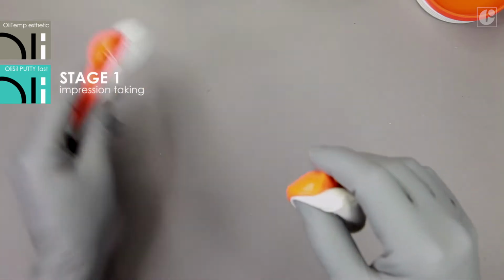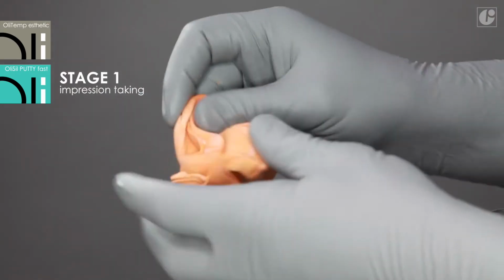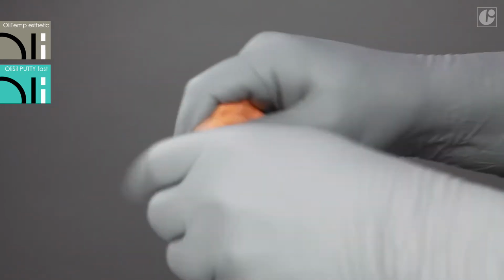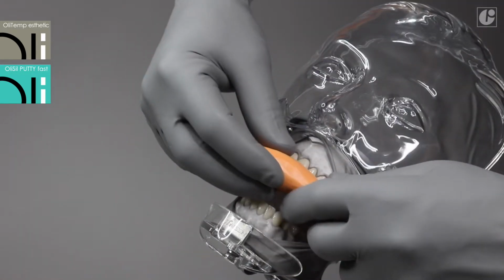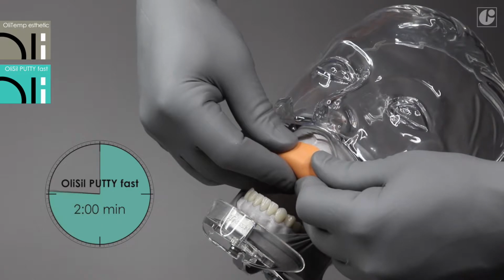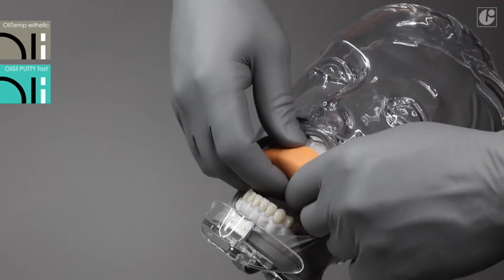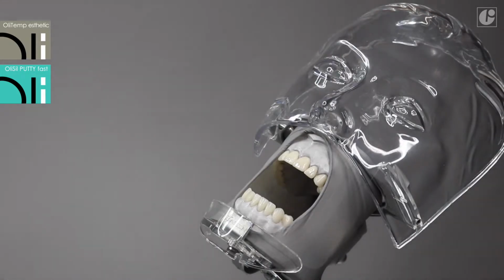When working with silicone impression materials, remember not to use latex and powdered gloves because contact with sulfur compounds may affect the setting process. The impression should be taken before teeth preparation. In the case of incomplete dentition, an acrylic tooth can be fixed in the place of a missing tooth. Additionally, OliSil Hydro was used to increase accuracy of the impression.